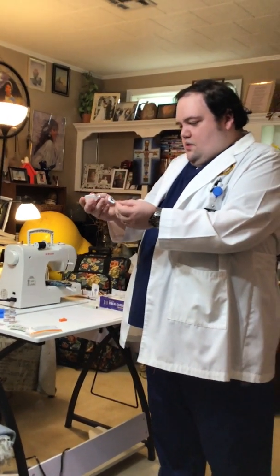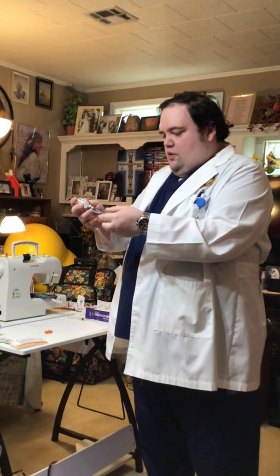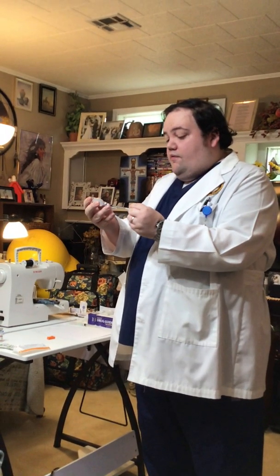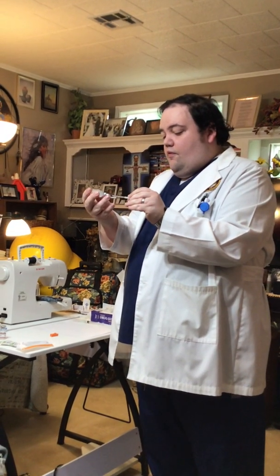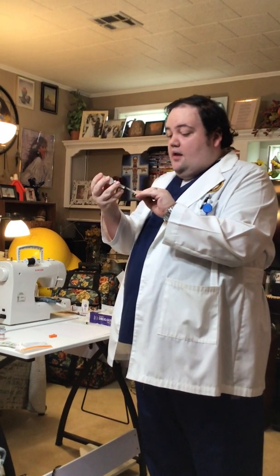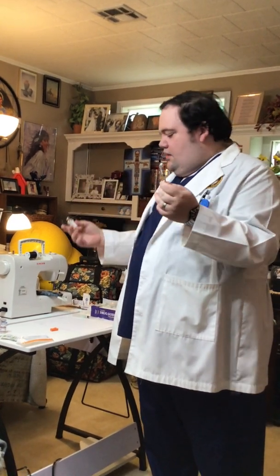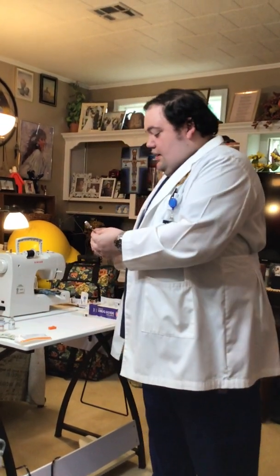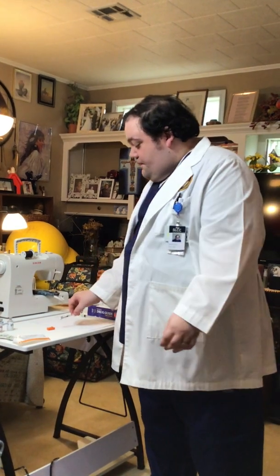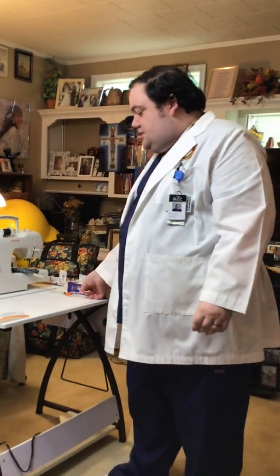So I'm going to do 25 units. Exactly 25. I'm going to scoop the needle up so that I don't touch it. There we go. That's his insulin.